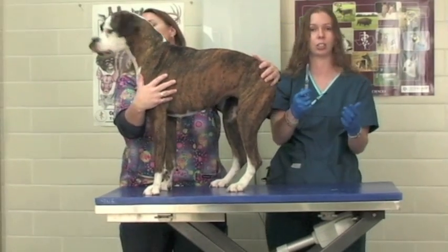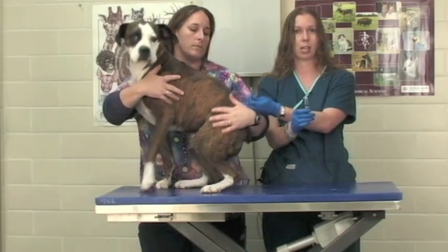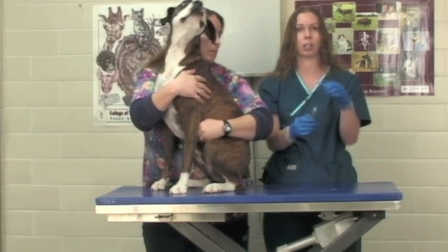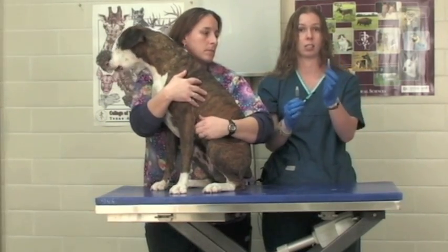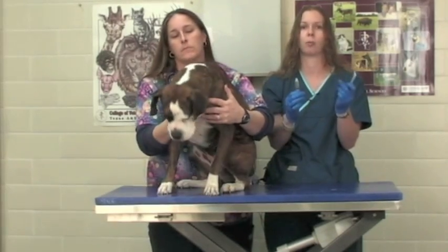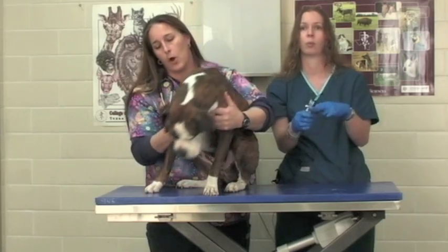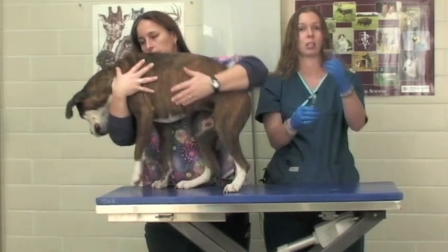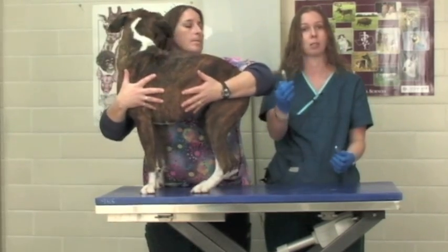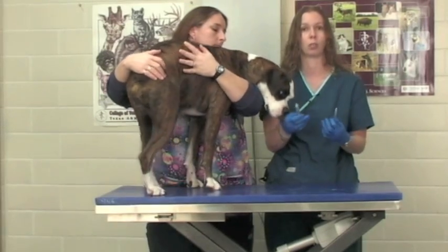Once you have your urine sample in your syringe, you can take the needle off that you poked into your patient's abdomen and place a new needle on it, because this needle has touched the surface of the patient's abdomen, and we don't want surface contaminants from the patient's abdomen to get into our sterile urine sample when it goes for testing. So we can place a new fresh needle on top and then submit it to our laboratory so that they can determine if there is anything going on with our patient's urine.